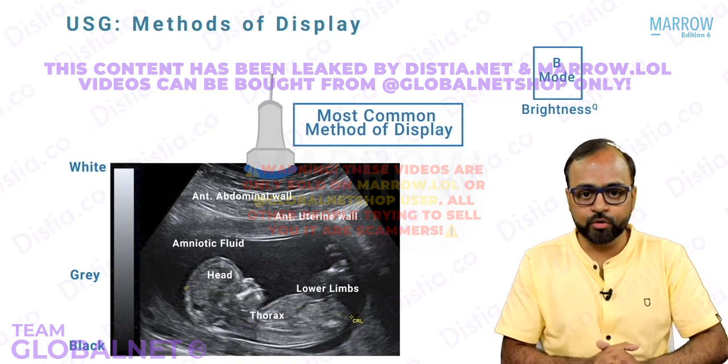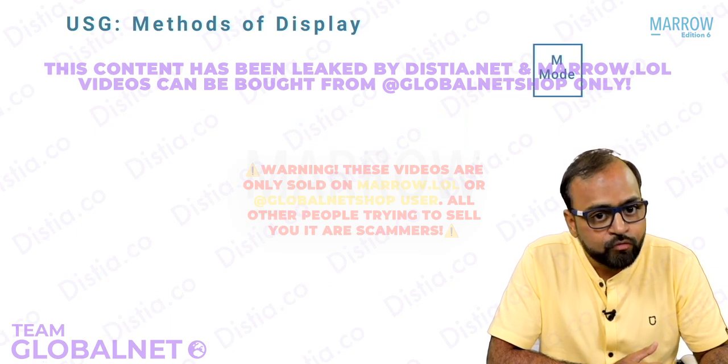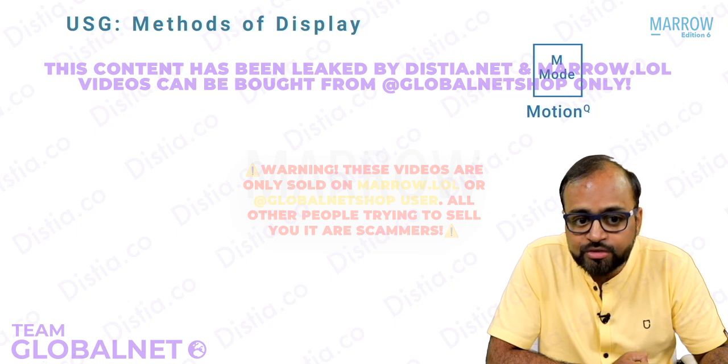After A mode and B mode, the next method of display is not C mode, but it is called M mode. What is M mode? M in M mode stands for motion. So what is it going to detect? It is going to detect motion.